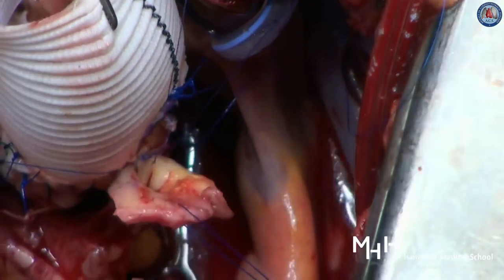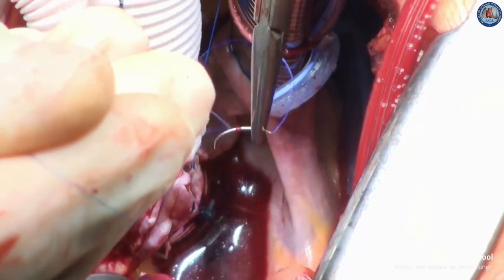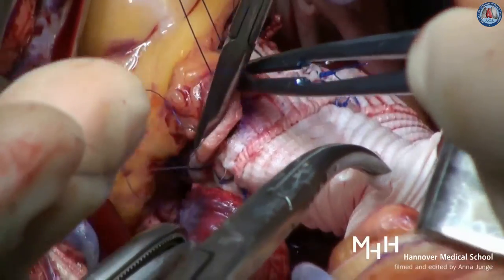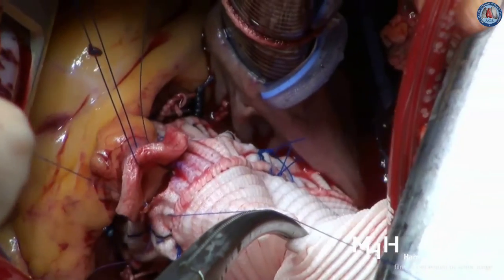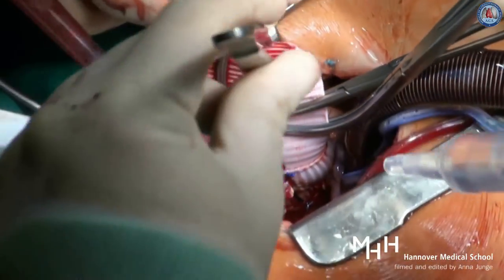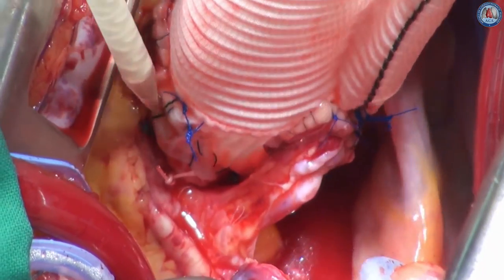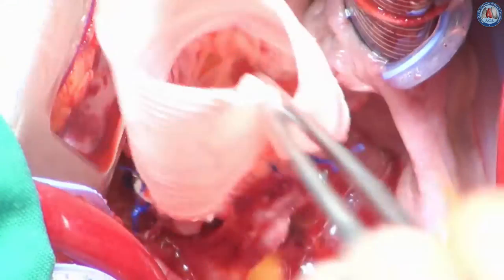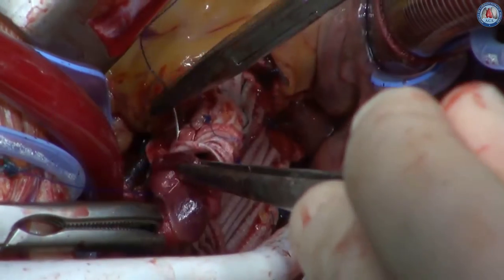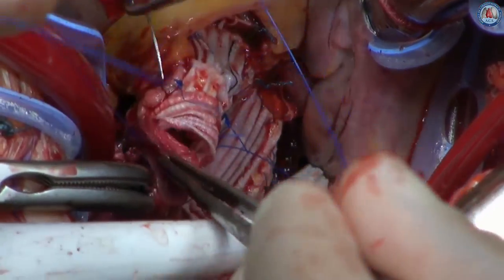The coronary ostia are re-implanted to the respective neo-sinuses using 5-0 polypropylene suture. Hemostasis of the coronary anastomosis and performance of the aortic valve are tested by pressurizing the aortic root with cardioplegia. Subsequently, the distal aortic anastomosis is performed, and after de-airing the left ventricle, the aortic clamp is removed.